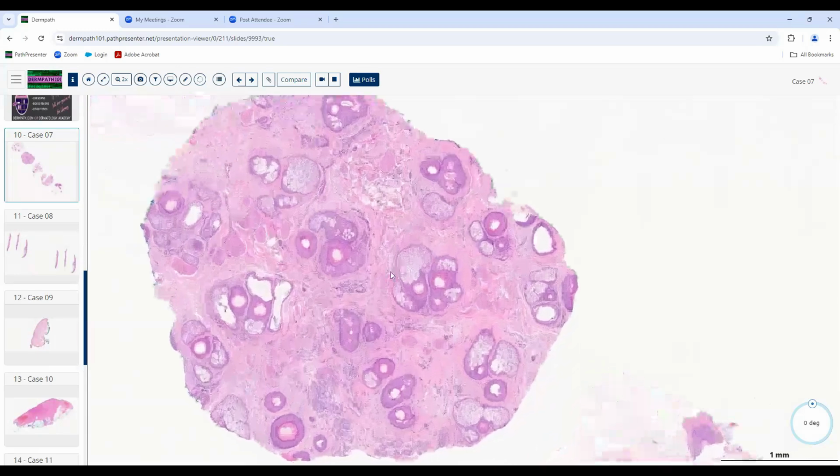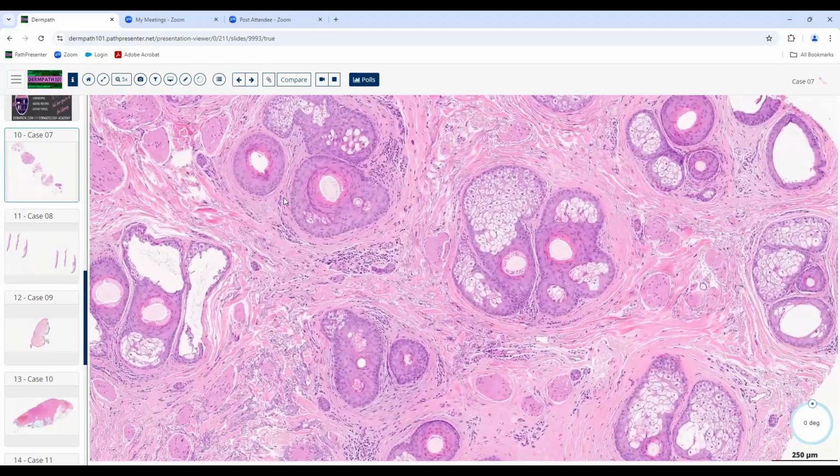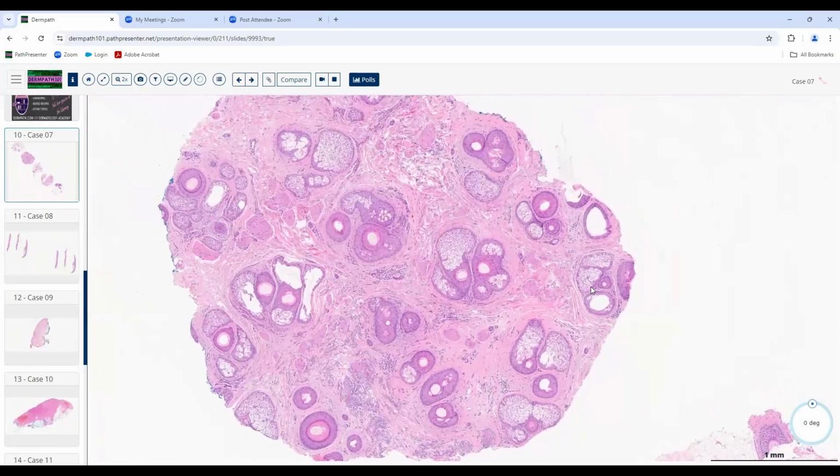So this is what happens when you see it on the transverse section. We're looking at it cut in the opposite way that we usually look at it. And you see all these multiple large sebaceous lobules with these small follicles, and then the absence of any other pathologic change. So we don't see 3 or 4 follicles lumped together with perifollicular fibrosis like we might see, for example, in a late-stage lesion of lichen planus.